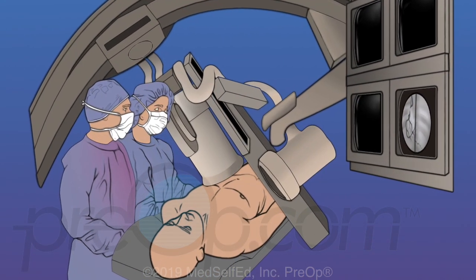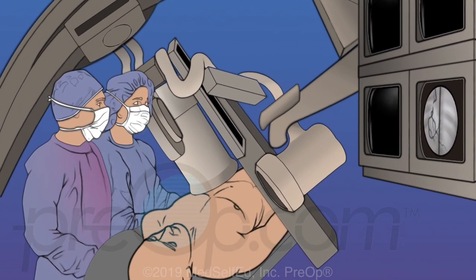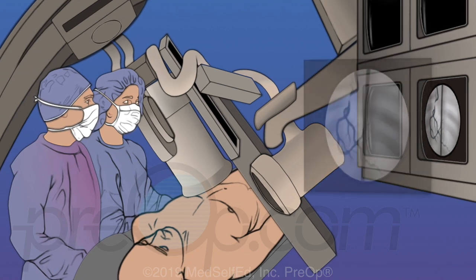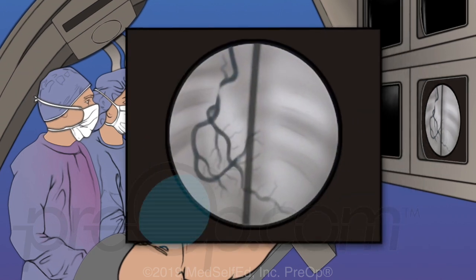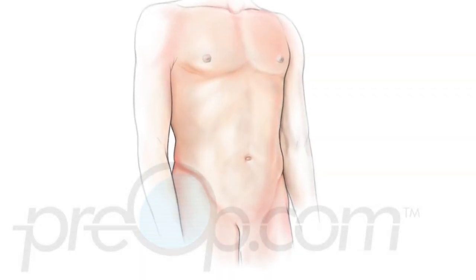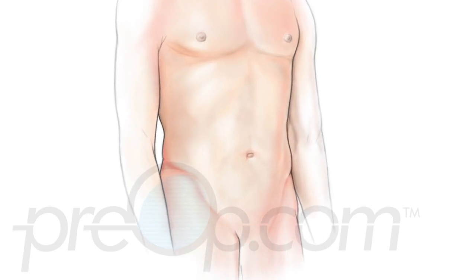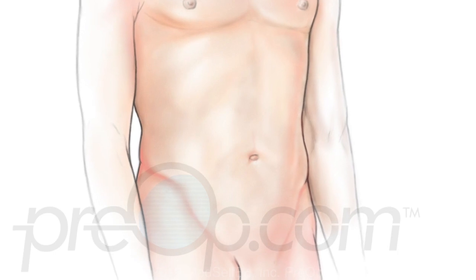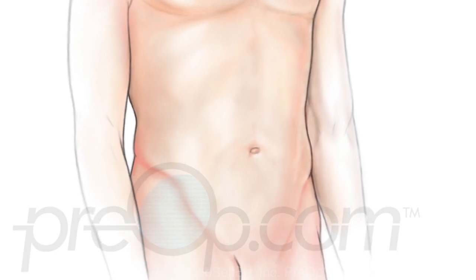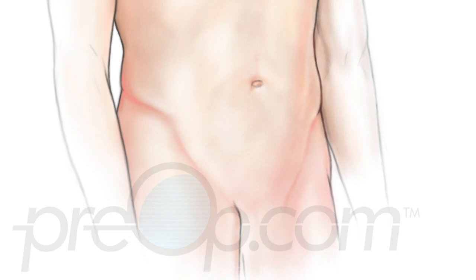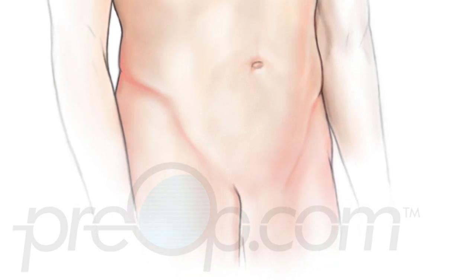A contrast dye that can be seen with an x-ray machine is given. X-ray pictures and video of the dye show the cardiologist how blood is moving through your heart. For your cardiac catheterization procedure, you will be positioned carefully on an x-ray table. The skin over an artery of your leg or arm is cleaned, then numbed with local anesthetic.